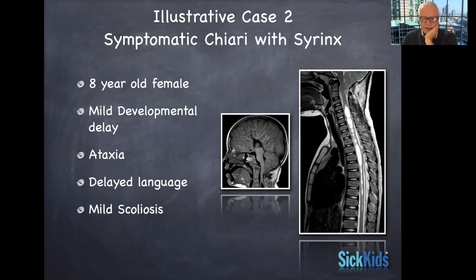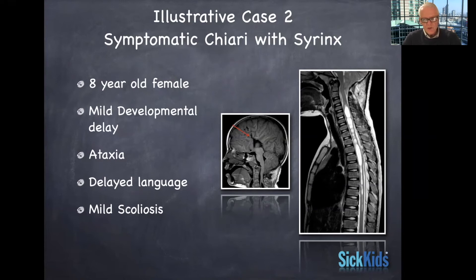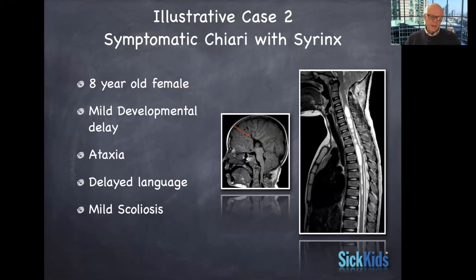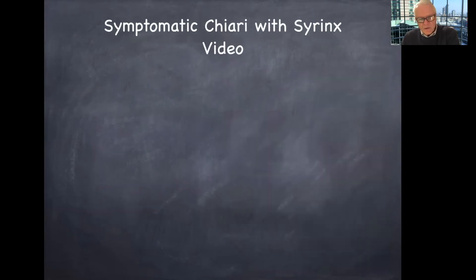But what are we missing here? The arrow is pointing at absence of the corpus callosum. This patient also has some underlying genetic disturbance that led to absence of the corpus callosum — the major association fiber bundle that takes information from one hemisphere and transfers it to the other.